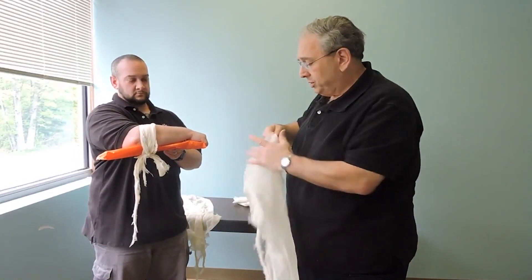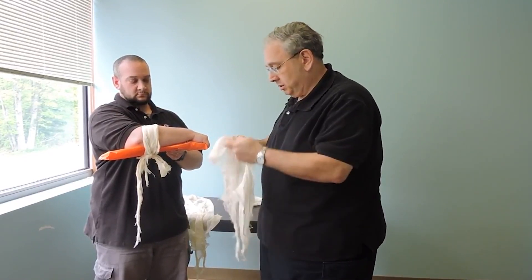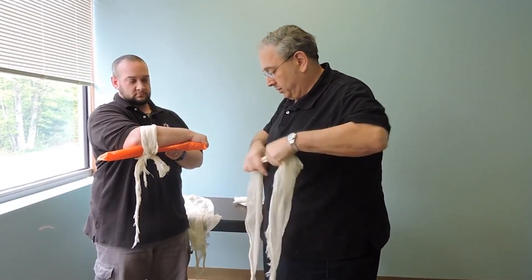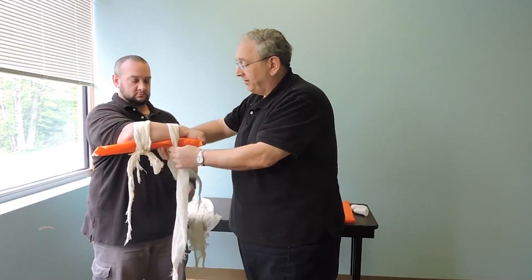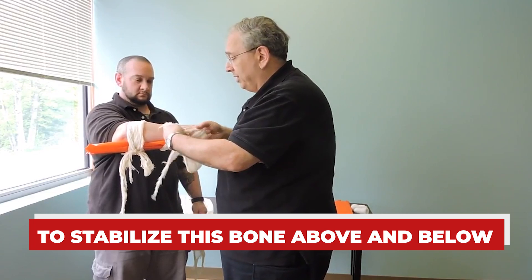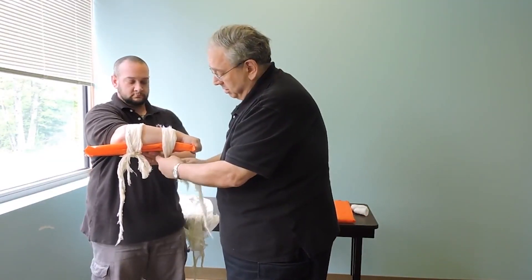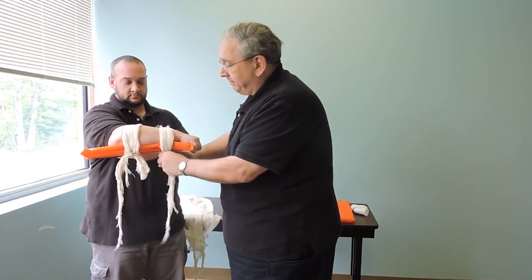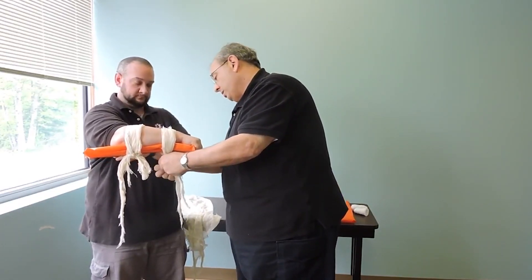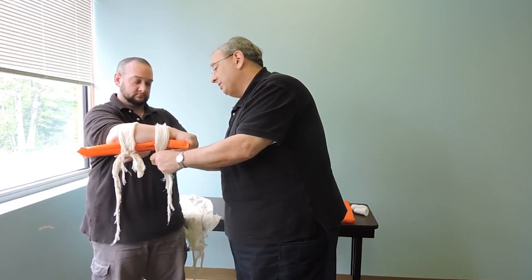The second cravat goes on the other side of the fracture. Remember the fracture is mid-shaft — I want to go just above it. The idea is to stabilize this bone above and below the site of the fracture. I'm going to tie it again with that surgeon's knot and tie it against the board.